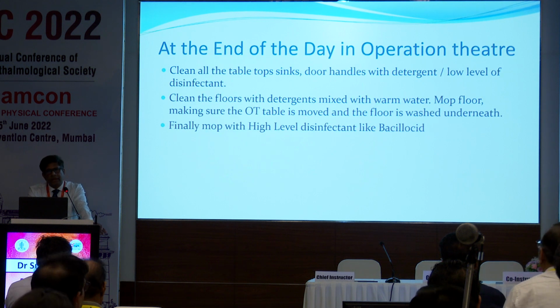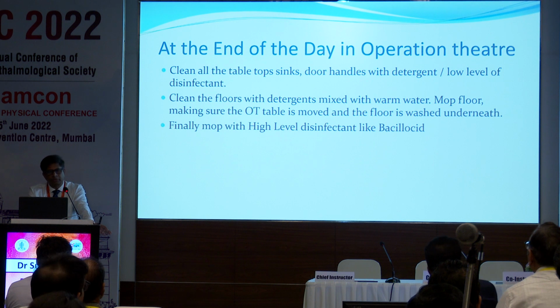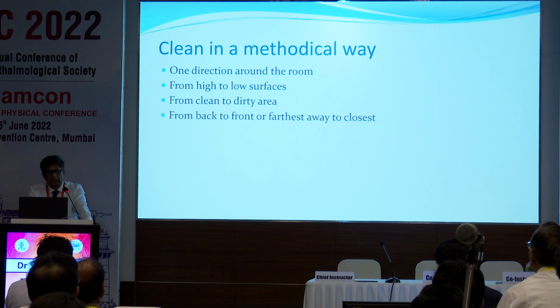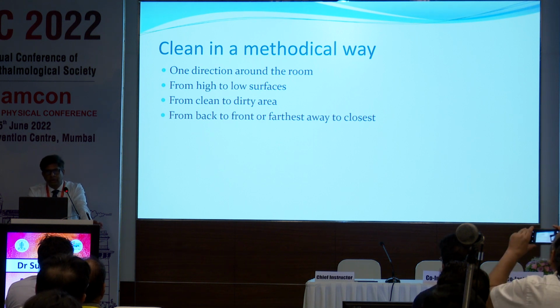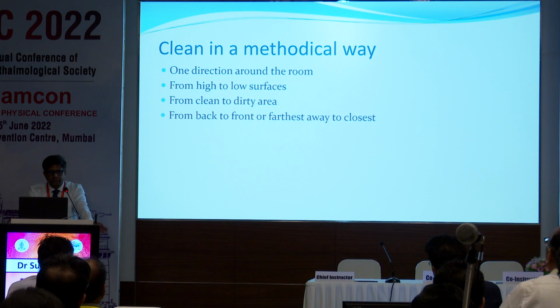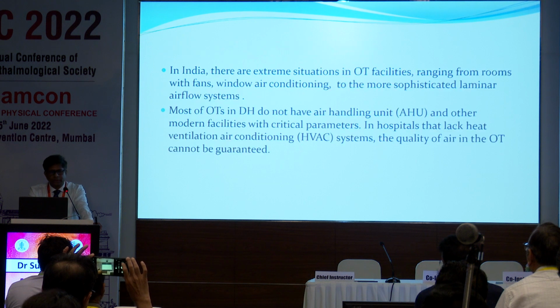And at the end of the day, also, there should be a rigorous cleaning, and at that time, ensure that the OT table is moved and the undersurface of the OT table is cleaned with a high-level disinfectant like bacillocid. So the cleaning has to be done in a methodical way. It should be in one direction around the room. It should be from high to low surface, from clean to dirty area. So the cleaner area should be cleaned first, and from back to front, or farthest away to the closest area.